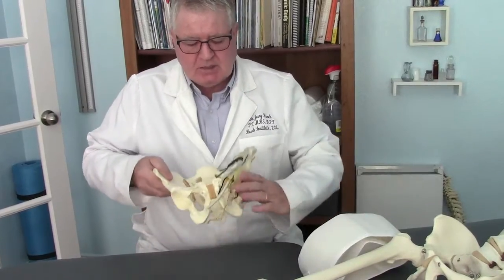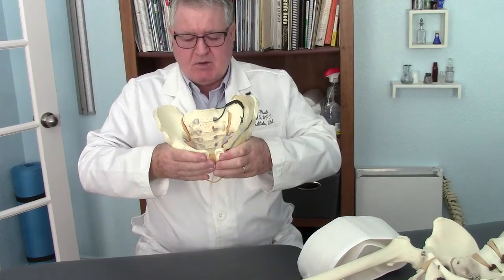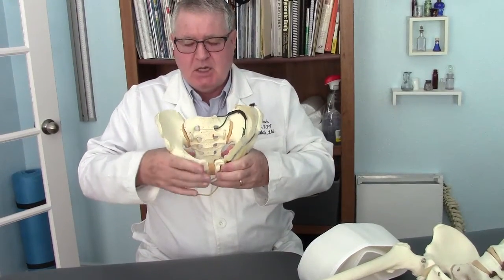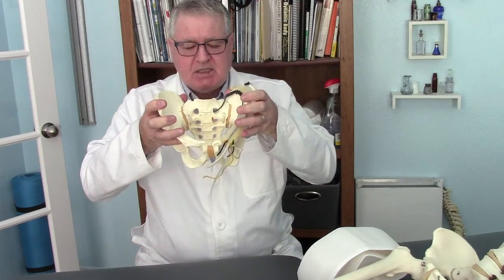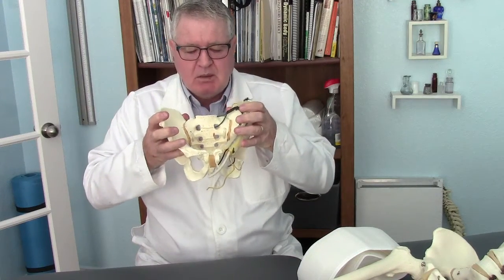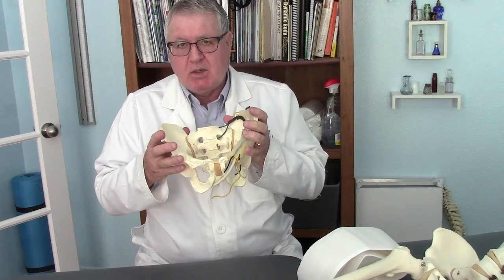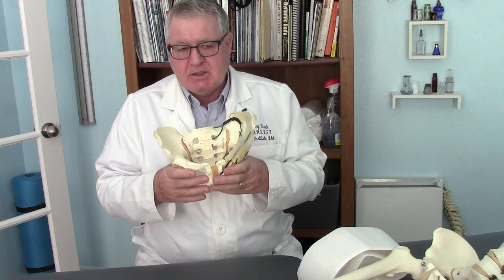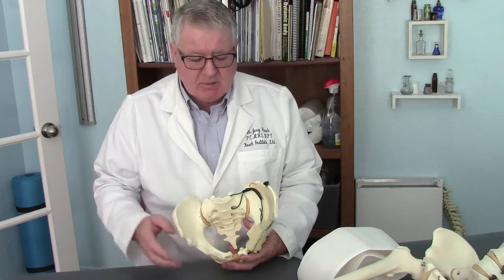If the compression is applied right here, both the pubic joint and sacroiliac joint are compressed. Whereas if you have a high placement, you can see that it tends to compress the upper sacroiliac joint, but it may in fact perpetuate hypermobility at the lower SI and lower pubic joint. So again, low placement is the preferred method. That's a brief summary of what we're going to cover now. There are exceptions to that, which we will discuss.